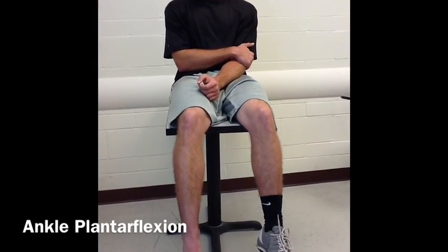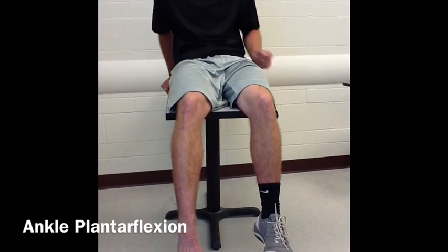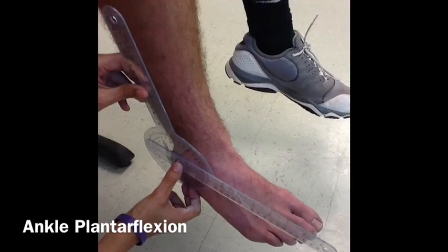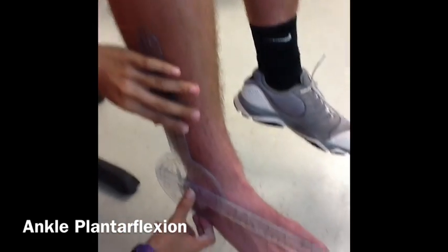Now, we will be measuring plantarflexion. Have your patient remain in a short sitting position with their legs hanging off the table. Align the fulcrum of the goniometer with the lateral malleolus. Place the stationary arm in line with the midline of the lower leg and the movement arm with the fifth metatarsal.